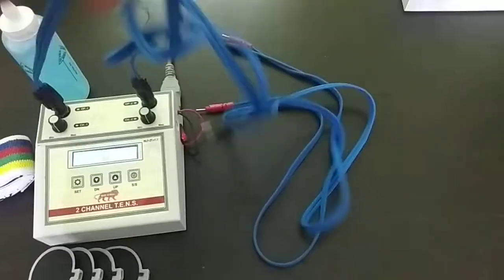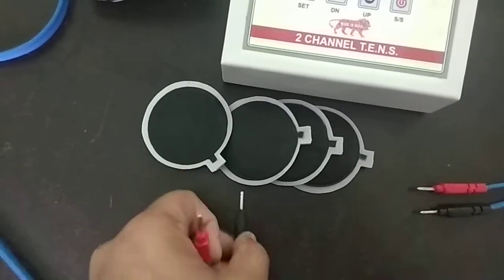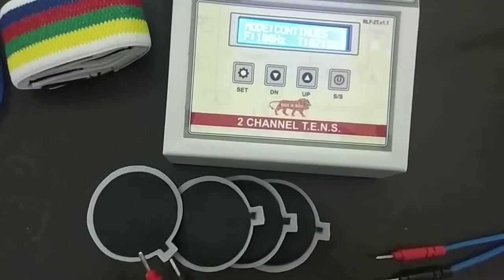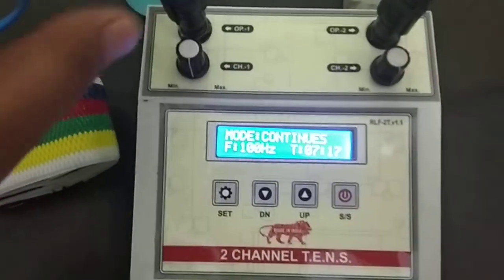So for channel 1, you have to apply pads in each wire. Now I am going to check channel 1.